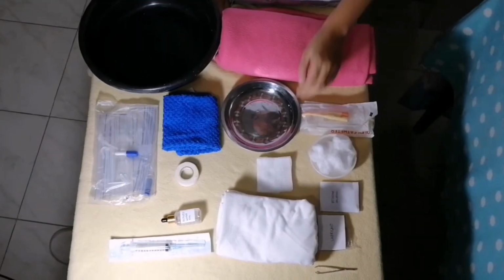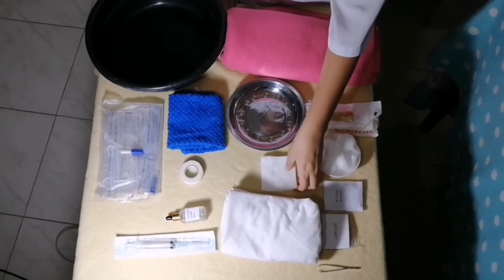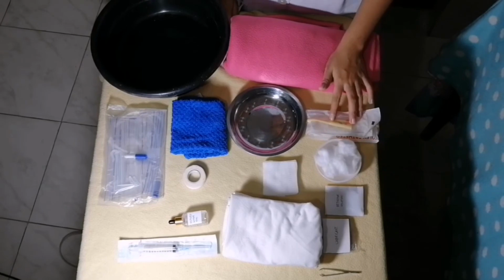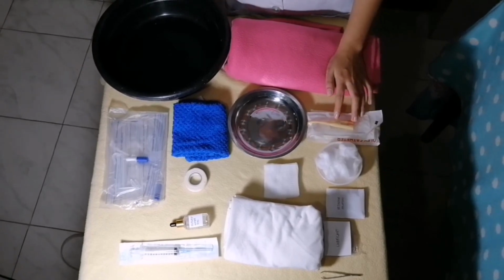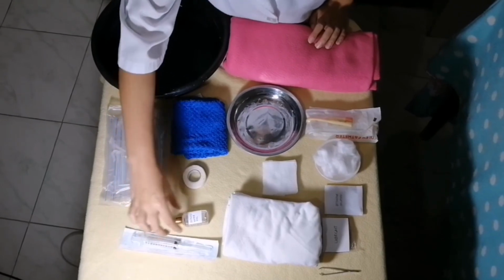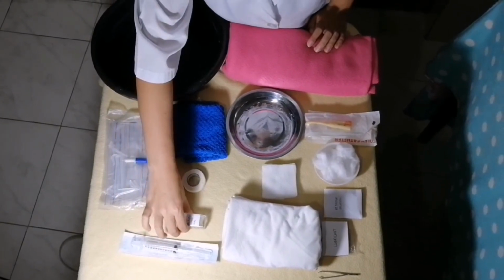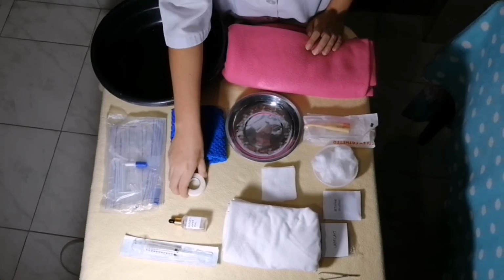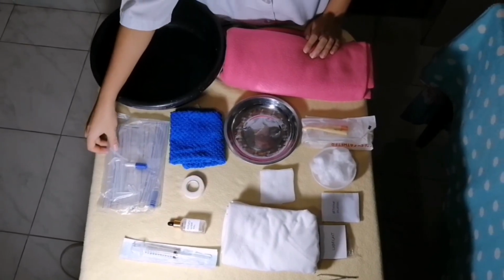We have here the operation sponge or gauze, the kidney basin, the Foley catheter, and the syringe. Here is the 10 cc syringe, the distilled water vial, the plaster, and the urine bag.